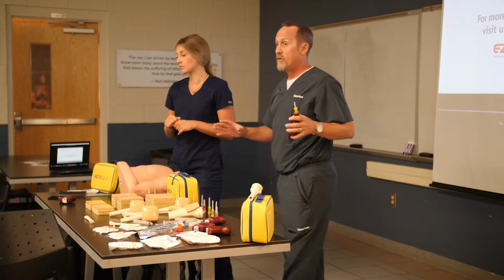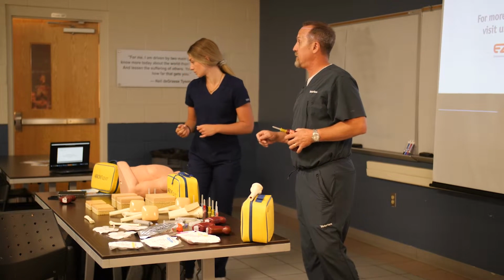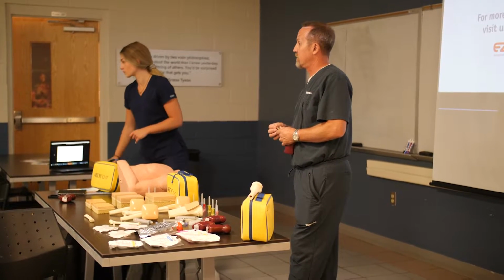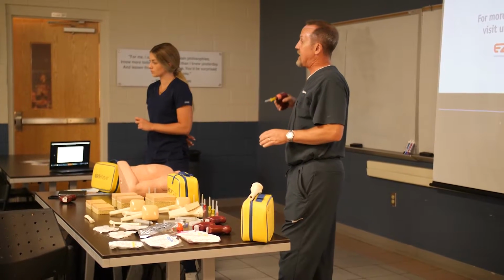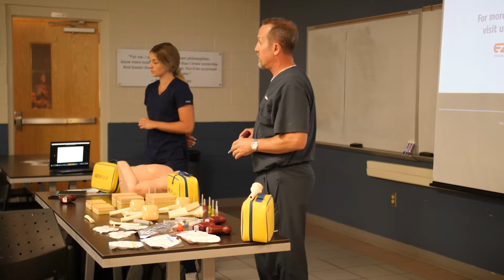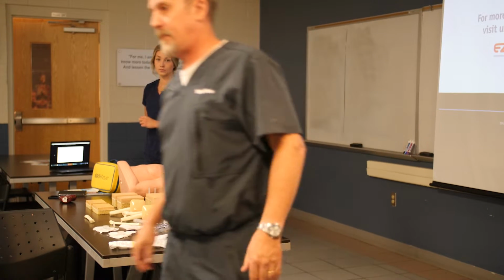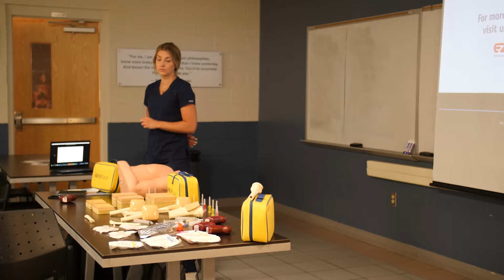So I kind of ran through all that landmarking stuff pretty quickly. The humerus, and the femur, you go parallel to the floor? You go 90 degrees to the aspect of the bone. So if you have the leg flat out on the floor, your needle's gonna be going parallel to the floor. Let's see. Which one are you looking for? Look at this little guy.